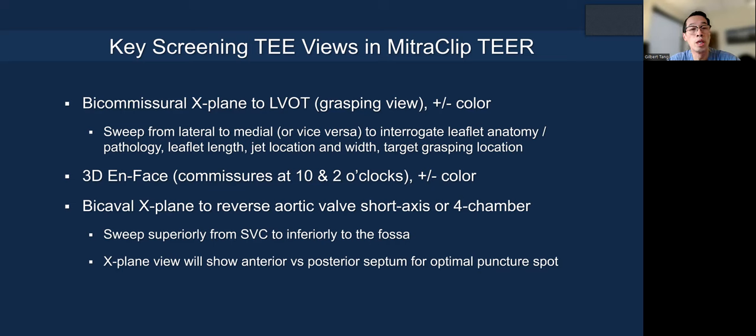The 3D en face series is very important. We place the commissures at 10 and 2 o'clock with or without color to show an anatomic surgeon's view to see how the anatomy and pathology look. For transeptal access, we use a bicaval x-plane to a reverse aortic valve short axis or four-chamber view. You sweep superiorly from the SVC down inferior to the fossa, because that's the direction the septum will be engaged with your transeptal needle system. Then do the x-plane view to show how anterior or posterior you are on the septum to optimize your puncture location.